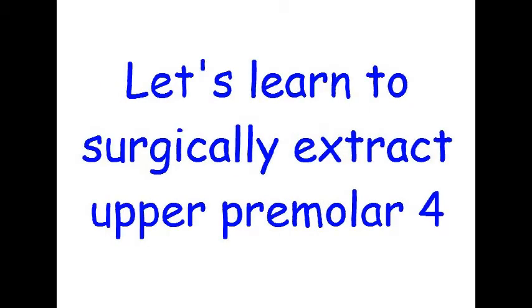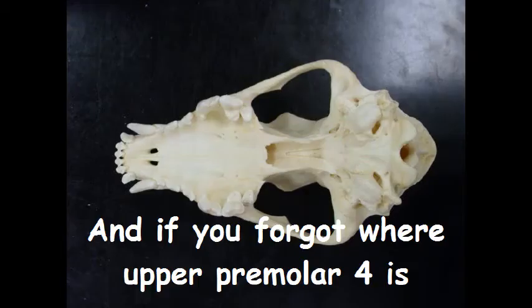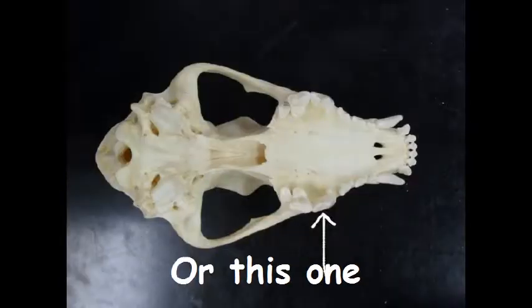Let's learn how to surgically extract Upper Premolar 4. You know what I'm gonna put in the tank? I'm gonna fill it up with motivation. And if you forgot where Upper Premolar 4 is, it's this one! Or this one.